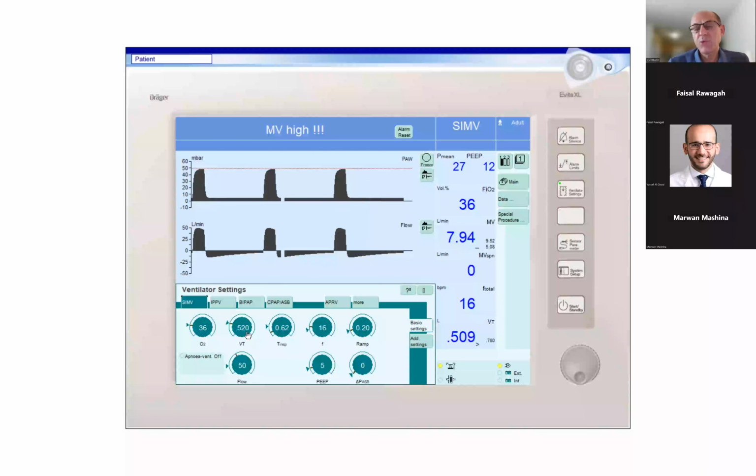A patient with asthma, tidal volume should be around 7 ml per kg. You did not ask about the weight of this patient. I can tell you the ideal body weight for this patient is 70 kilos, meaning that if you give him 7 ml or 8 ml per kg, that should not be more than 560. Okay. So we are again at the ABG. Yeah, the CO2 is 44, and you're doing everything possible to eliminate the auto-PEEP.